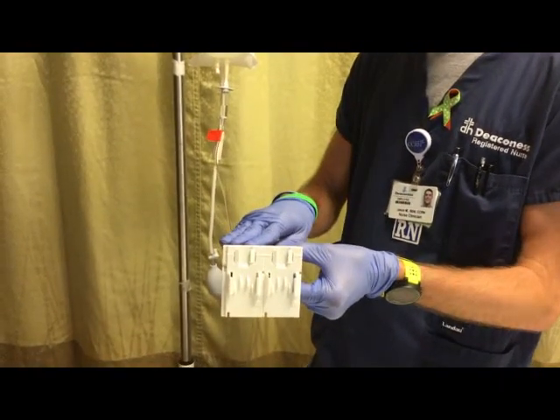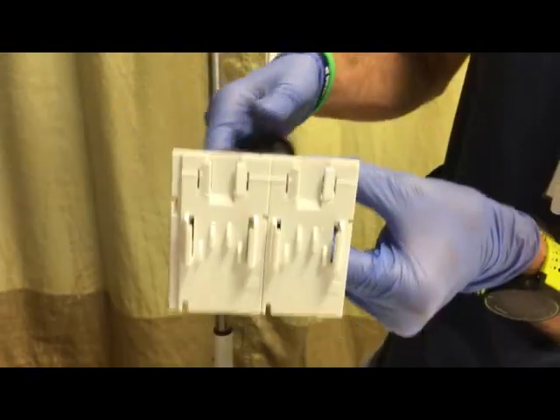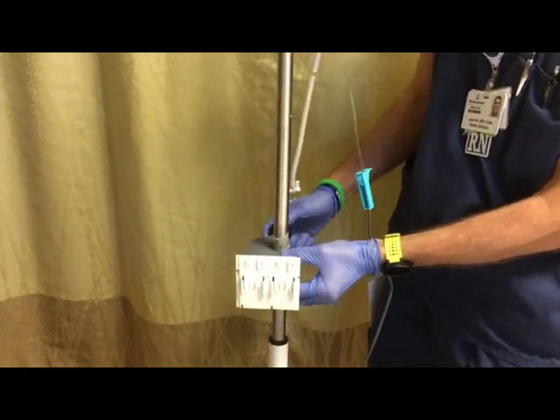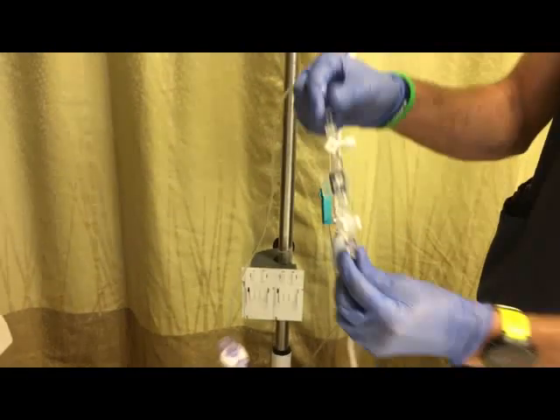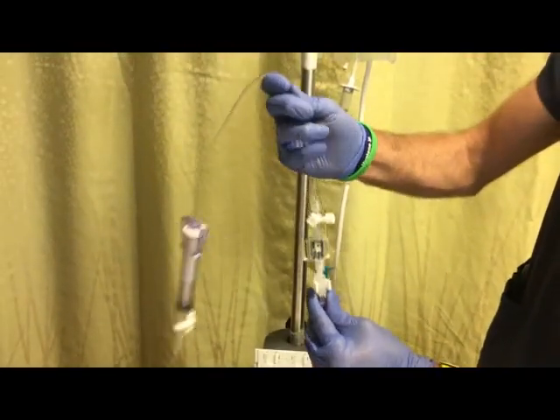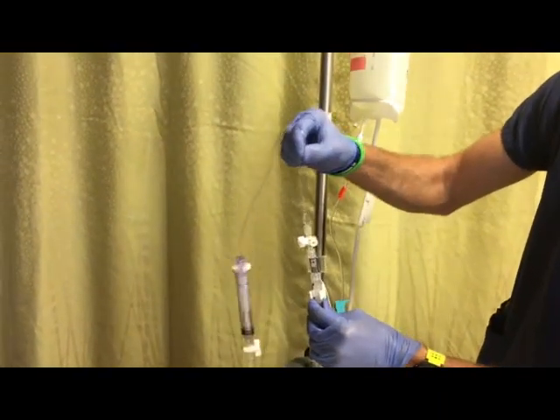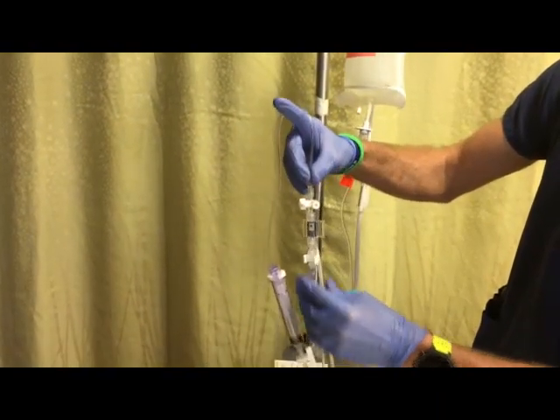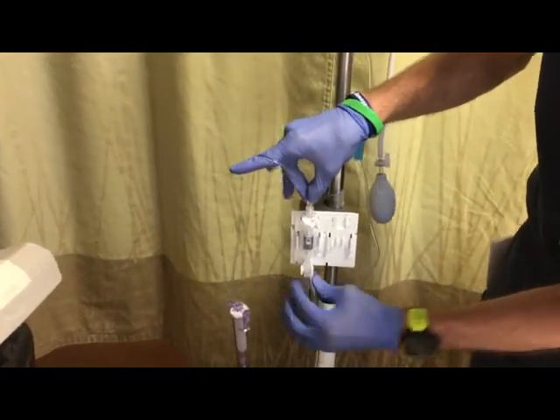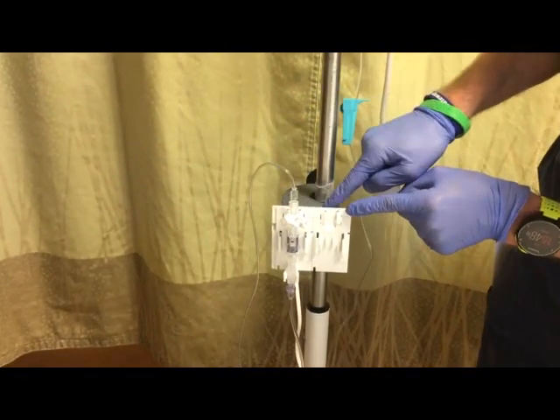To apply the transducer holder to the pole correctly, the zero line of the transducer holder should always be on top. Screw it to your IV pole. When applying the transducer to the transducer holder, there are a couple of different ways to remember correct placement: up to the patient and tail down, or keep in mind the hard non-compliant tubing goes up and the soft compliant tubing goes down. Note that when inserting it into the transducer holder, the air-fluid interface lines up perfectly with the zero line of the transducer holder.